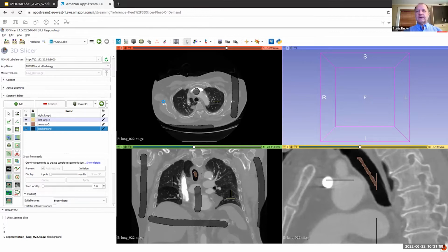Just referring back to your presentation earlier, what we've done is preload all these data sets so that everything is ready to go, shifted from a bucket into the SageMaker instance. Is that what's going on?